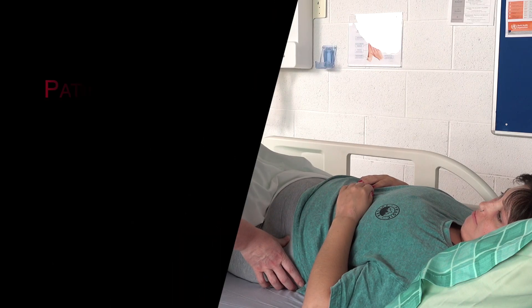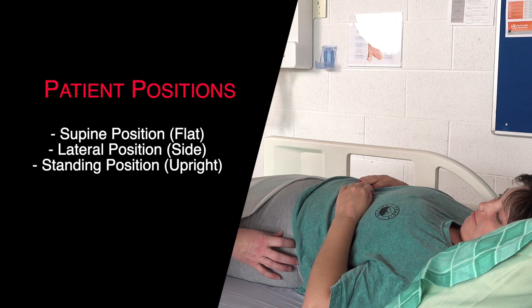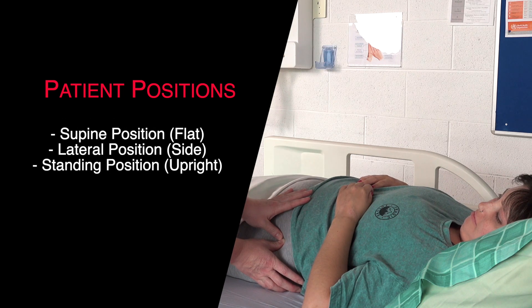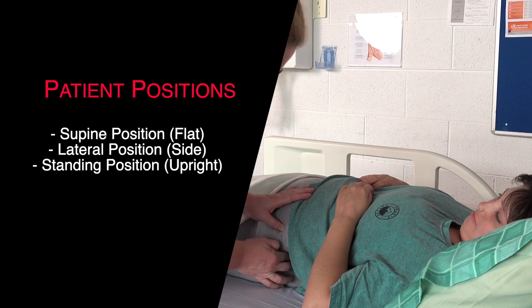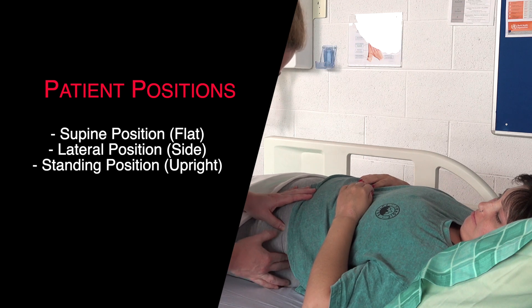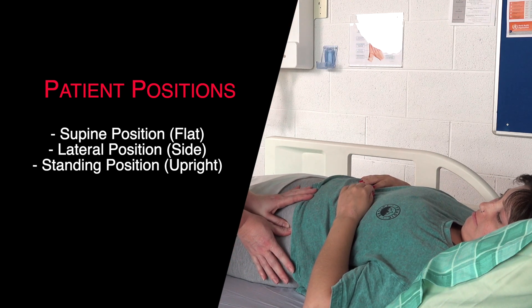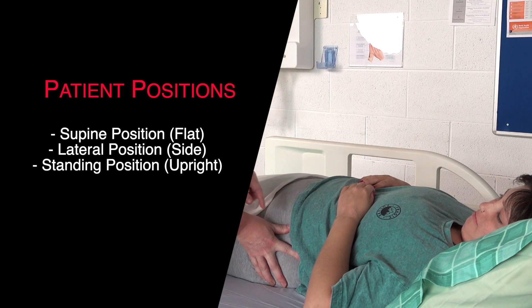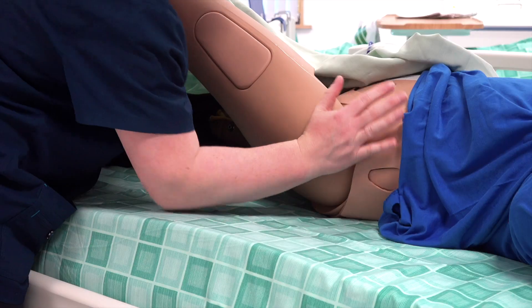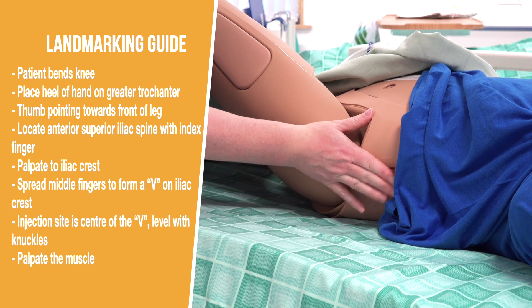The patient may lie on their back in the supine position, on their side in the lateral position, or they may stand. Ask the patient to bend their knee on the chosen side — this maneuver helps in locating the greater trochanter. For this recording, the patient is lying in the supine position.